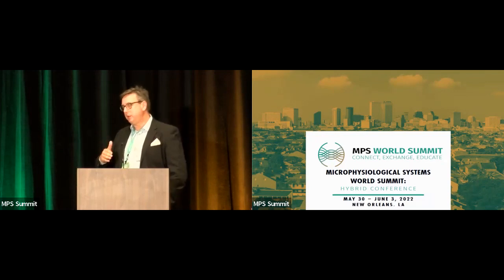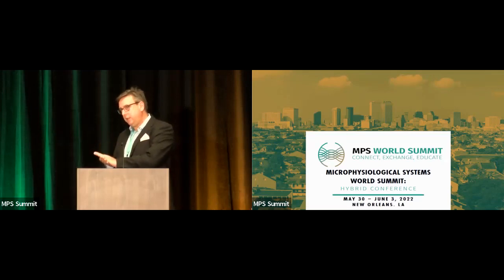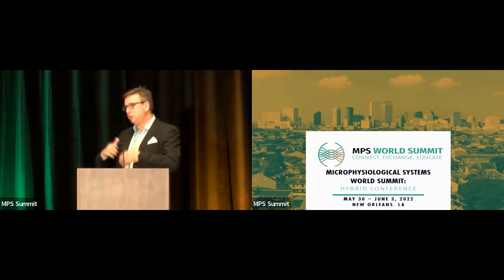But we have different progression of the disease. And our main interest at the moment is that we are able to basically classify the 3D tissues into the same buckets as a human pathologist would classify the biopsies. That's limited to a certain extent because clearly the tissues are quite small. They lack some of the features of a biopsy. You don't have a portal vein, for instance. So I think there is still a bit of translation that we need to do.